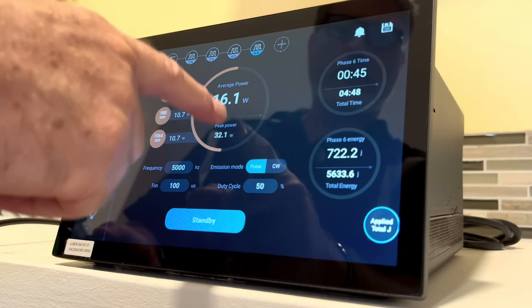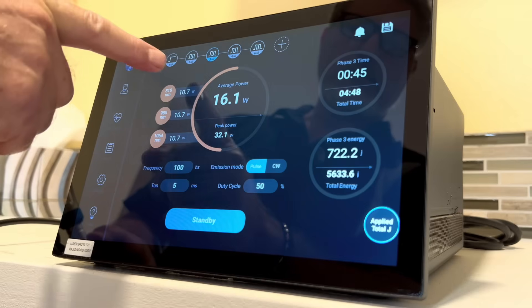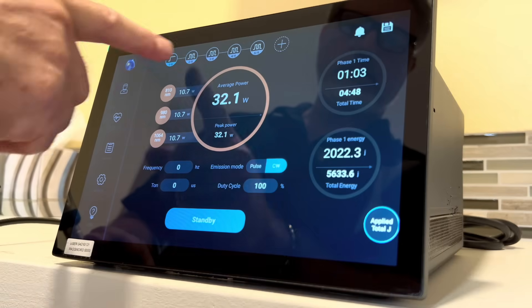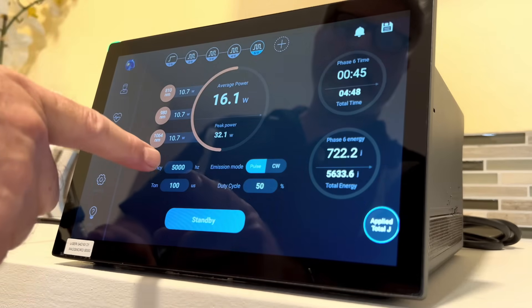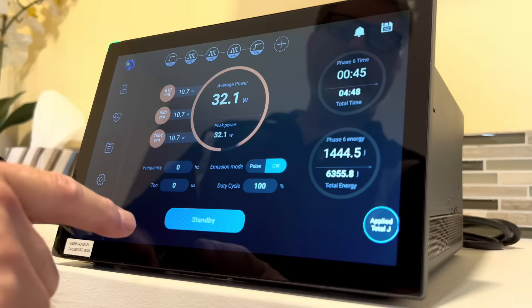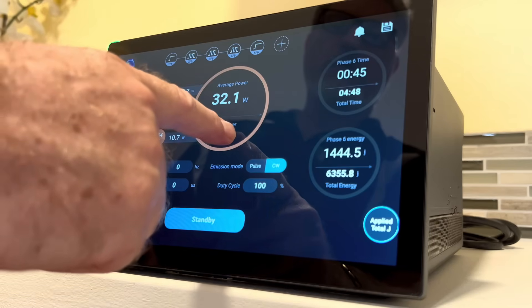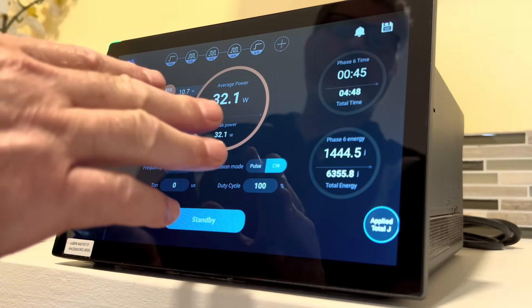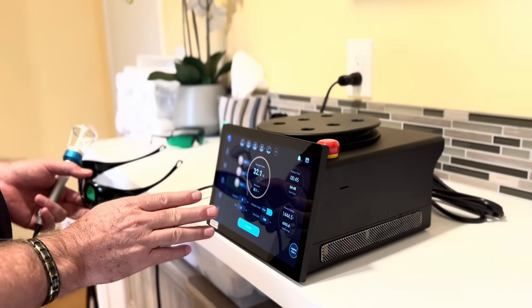Looking at the different configurations, what's changing is the frequency: here we have zero, ten, one hundred, five hundred, and five thousand hertz — those are all the options. And if you just want no pulse, only continuous wave, you get 32.1 watts average power and 32.1 watts peak power. With a different protocol it could be up to 45 watts. There's also the ability to program and create your own custom frequency and power settings and save them for easy future use.